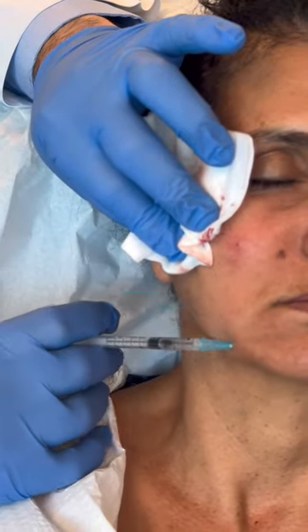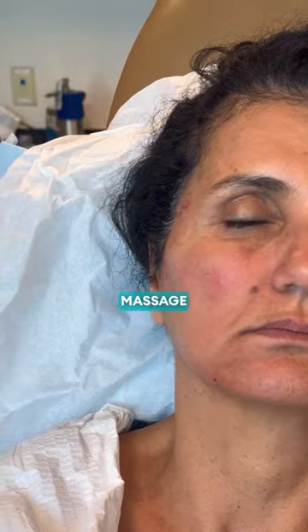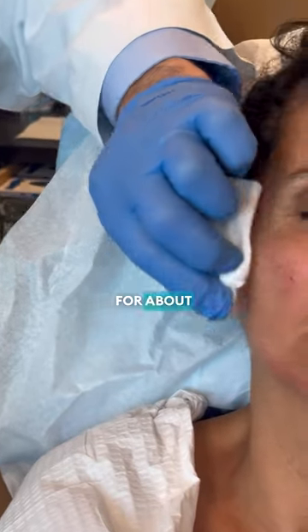Now along the jaw line, into the chin a little bit. For the patients, after they get the treatment, we want them to massage their skin — five times a day, for five minutes, for about five days.